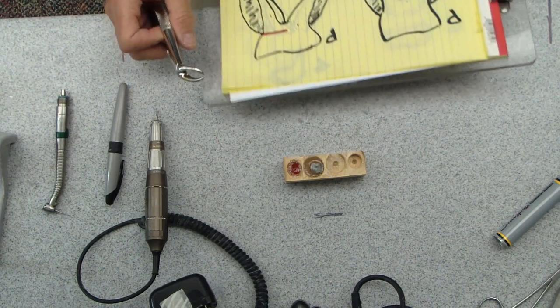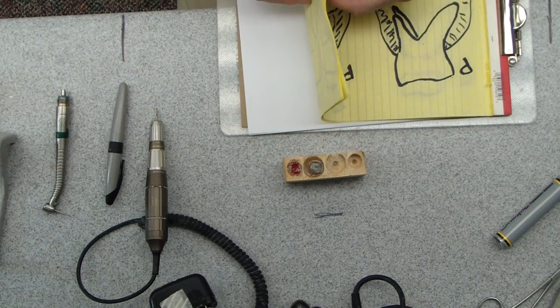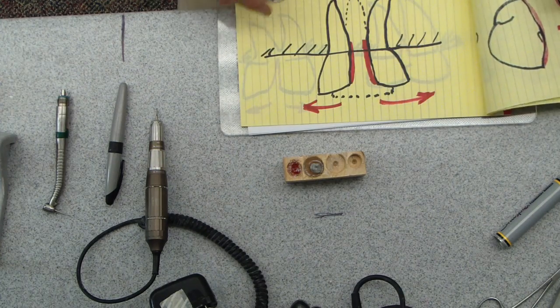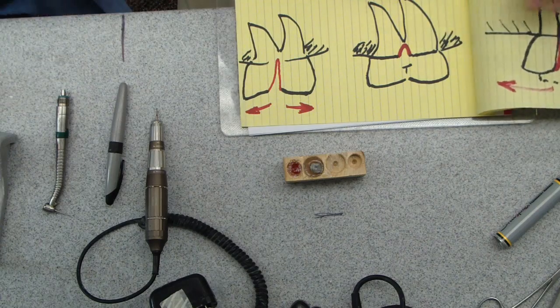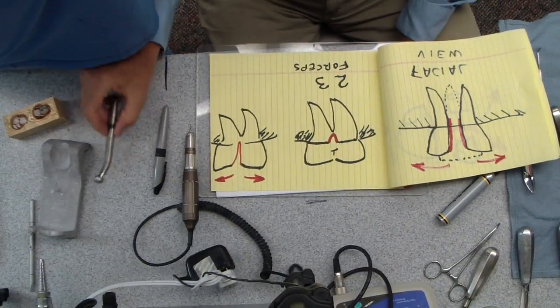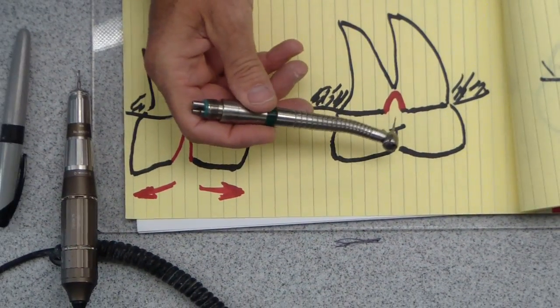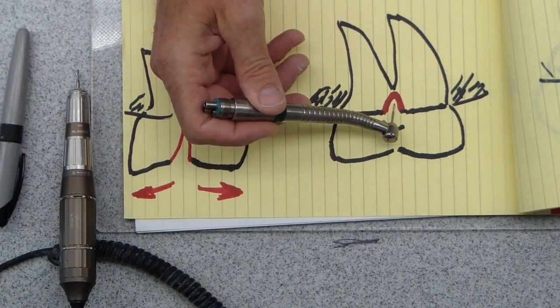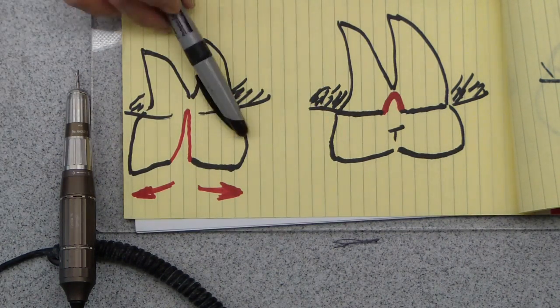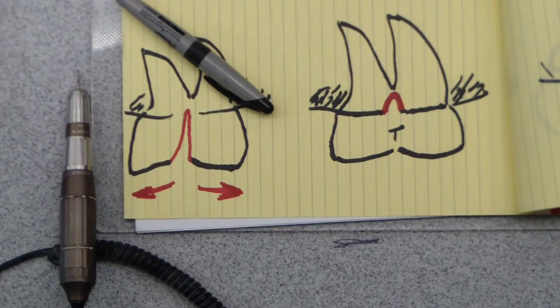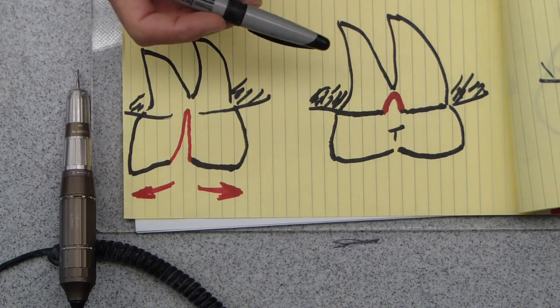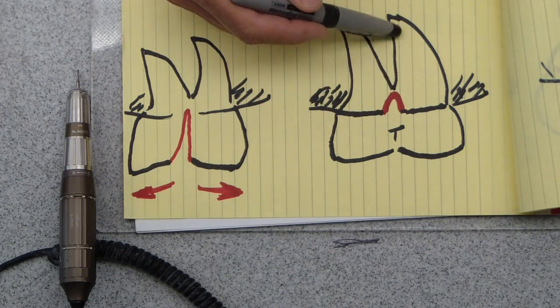A lot of times you can't get it down into the furca, so what I like to do is kind of cheat a little bit and make a little bit of access to the furca. What I do on these is I'll just take the handpiece with my little burr and I'll just go down almost like doing a crown prep, except I'll just do a small little access just on the buccal and also on the lingual. What that does is it allows the beaks of your cow horn to get down there a little deeper.